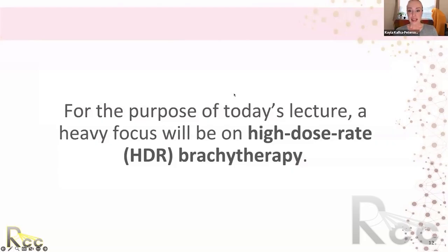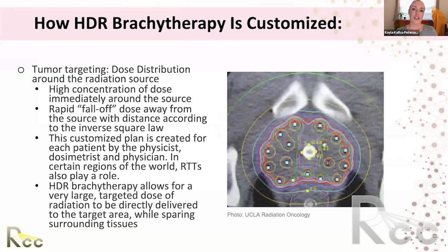So for the purpose of today, we will focus on high dose rate brachytherapy with an emphasis on GYN. So how is HDR brachytherapy customized? The magic happens once the needles or the applicator is in where it needs to go. That is where the physicist and the physician and dosimetrists, and also in some parts of the world, RTTs, have this role of creating this customized treatment plan.